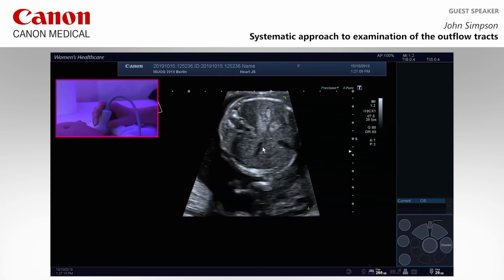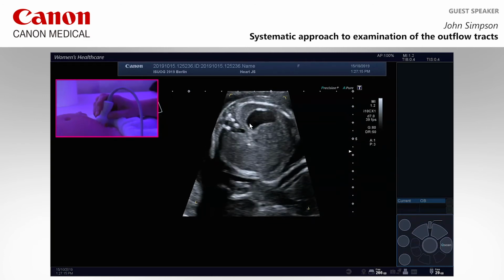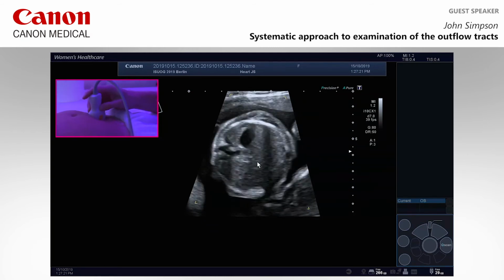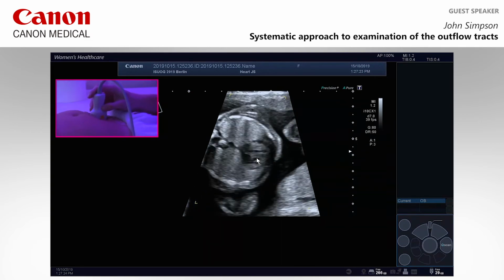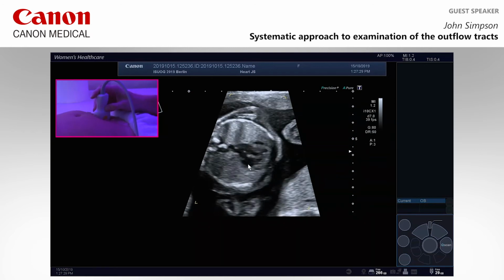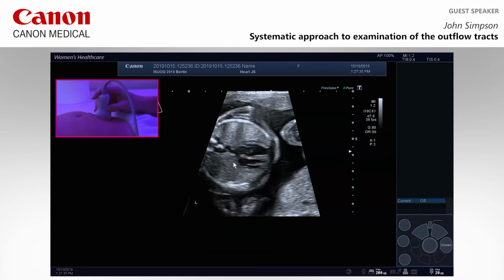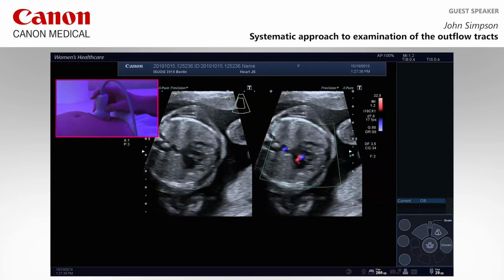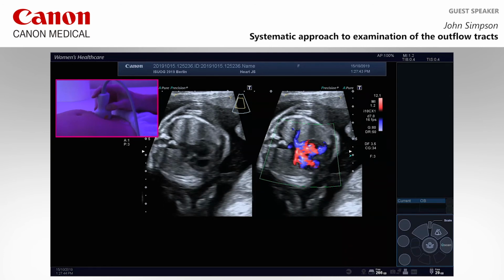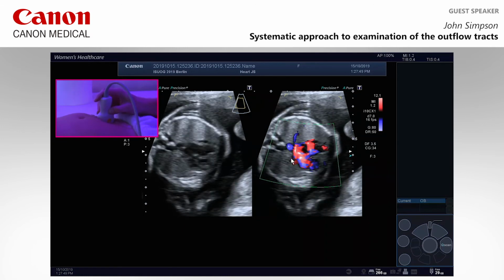So again, I'm going back to the start, finding single rib, left stomach, descending aorta. We've got nice views of the ventricular septum here, which again is not part of the subject, but it's showing up quite nicely here. Pulmonary veins coming into the back here. Just because we can see them, I'll show you them using the ADF. We need to take the scales down. And now you're seeing the pulmonary veins coming in at the back here, both on the left and then the right on the right-hand side.